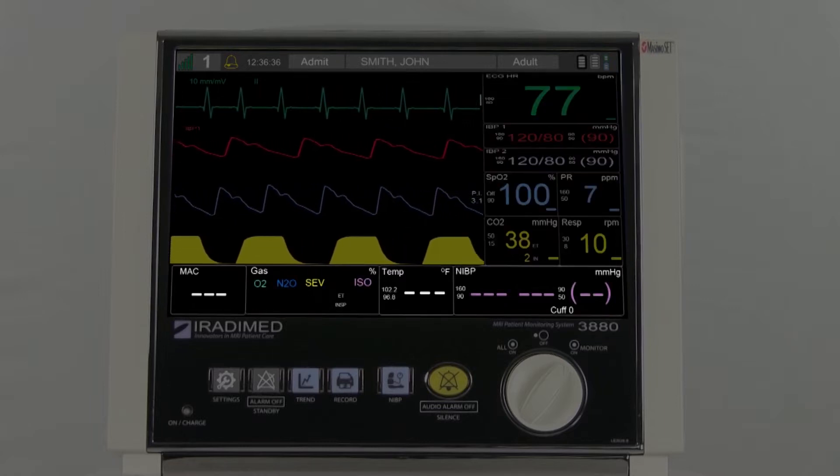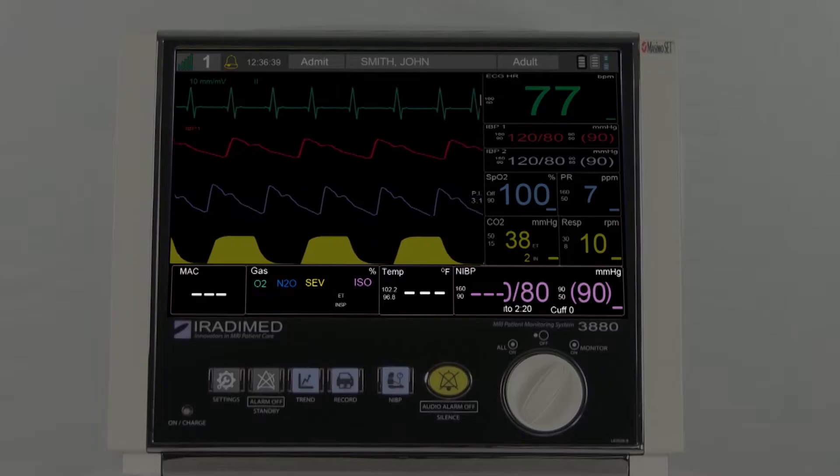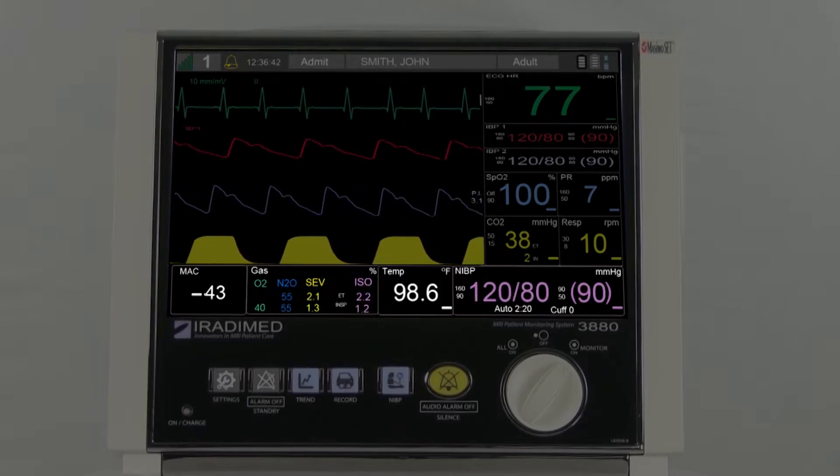Finally, on the bottom section of the screen, the user will see the non-invasive blood pressure, temperature, gas, and MAC readings.